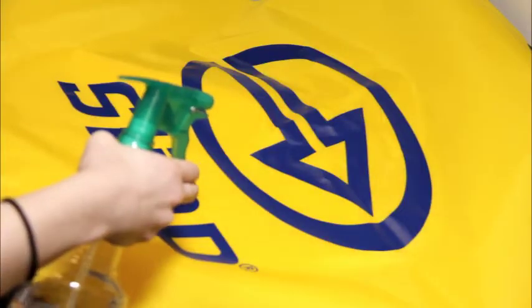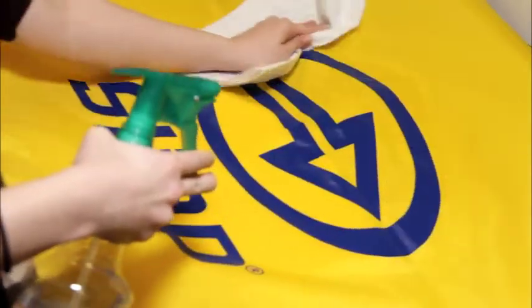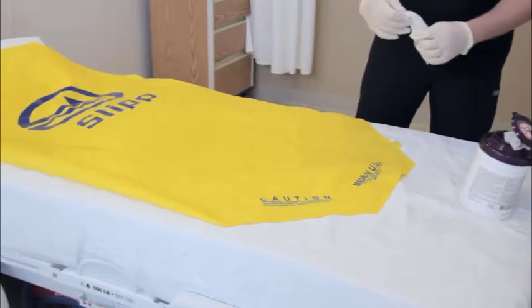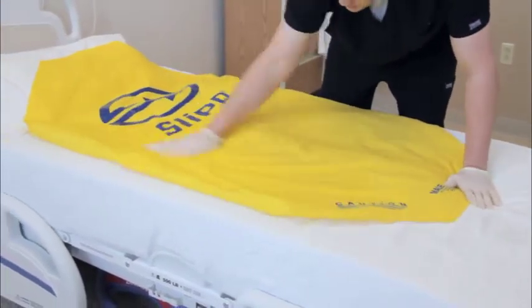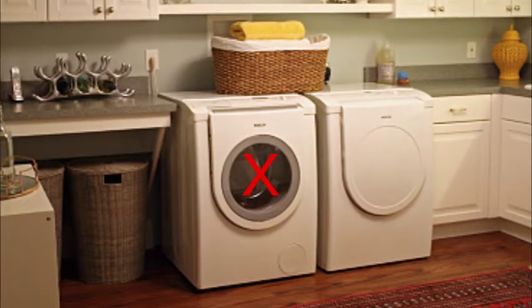To clean, simply wipe the Slip with any antimicrobial or germicidal solution or with a 5-10% bleach solution. Be sure to dilute any cleaner you use to the manufacturer's instructions. If the Slip becomes extremely soiled, it can be machine washed. However, it cannot be machine dried.